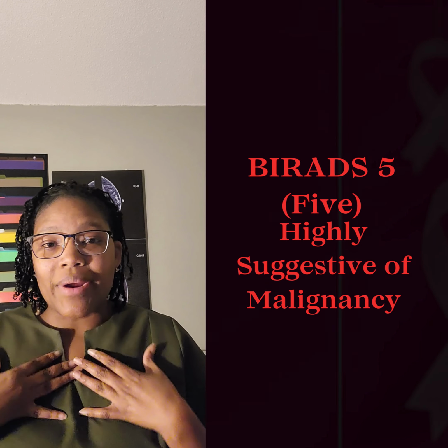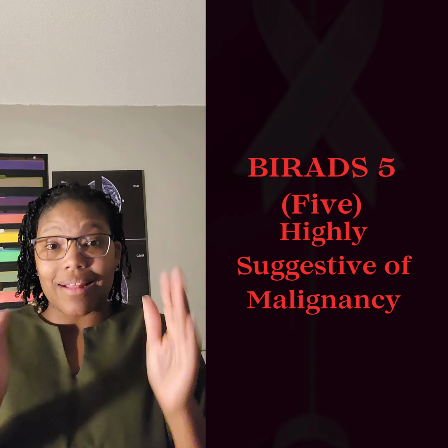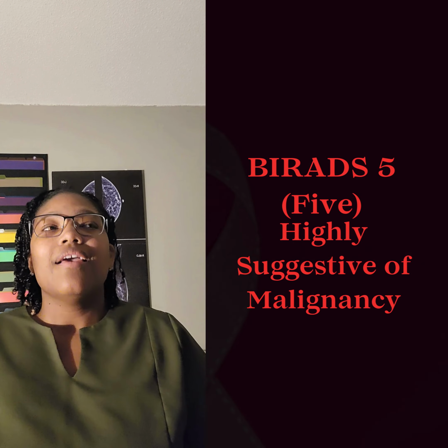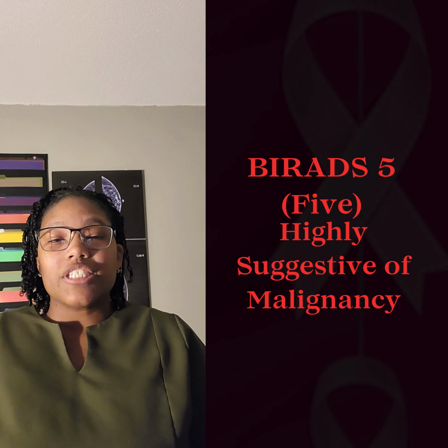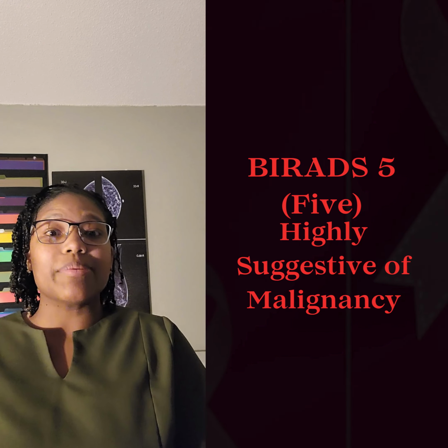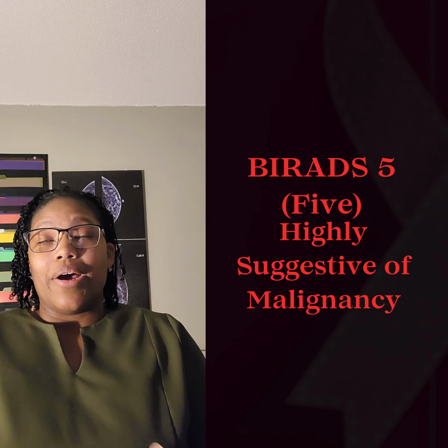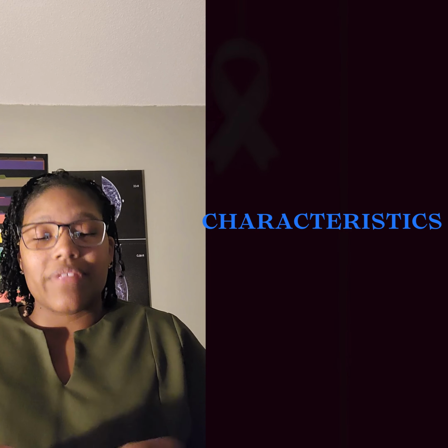Now, a BI-RADS 5 is when the area of concern is highly suggestive of being cancer. On our end, we will see a BI-RADS 5, but we will inform you, not by letter, but we will call you first and let you know that this area is highly suggestive of being malignant or cancerous. You need to come in for a biopsy, and then we can definitively know.